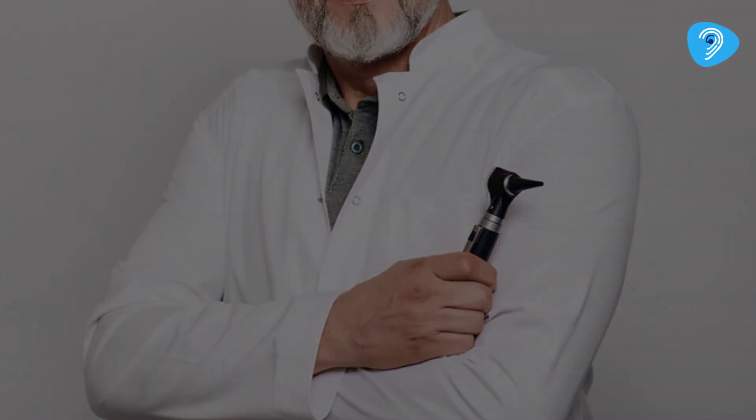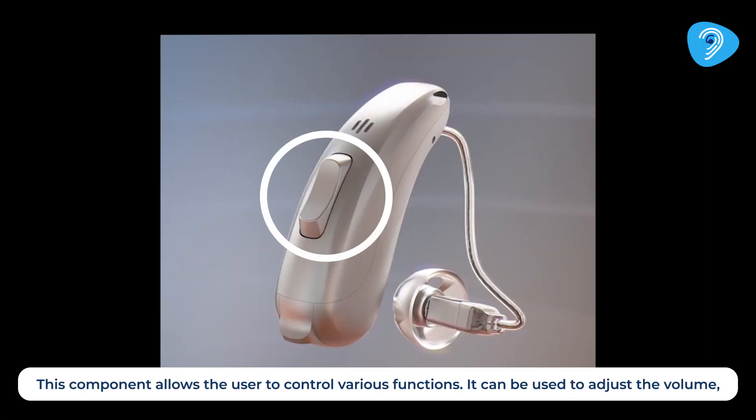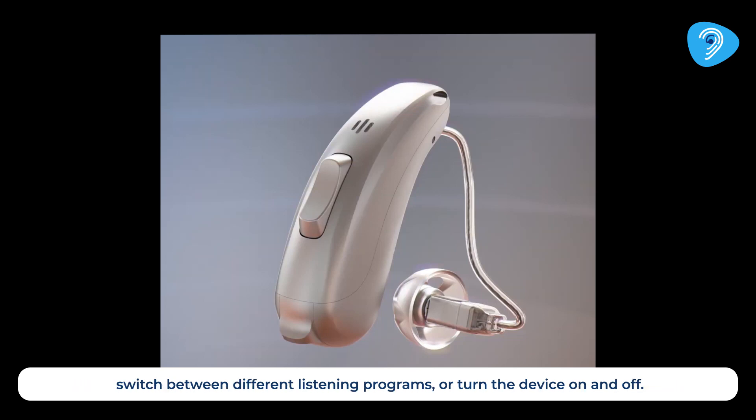Next, we have the button or switch. This component allows the user to control various functions. It can be used to adjust the volume, switch between different listening programs, or turn the device on and off.